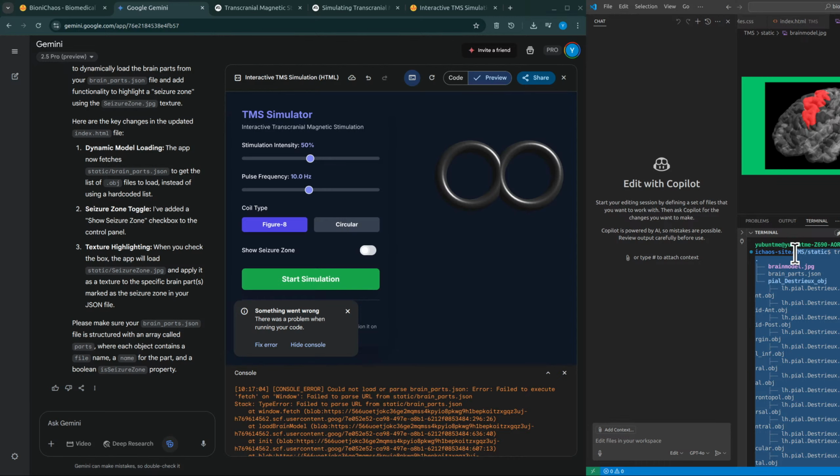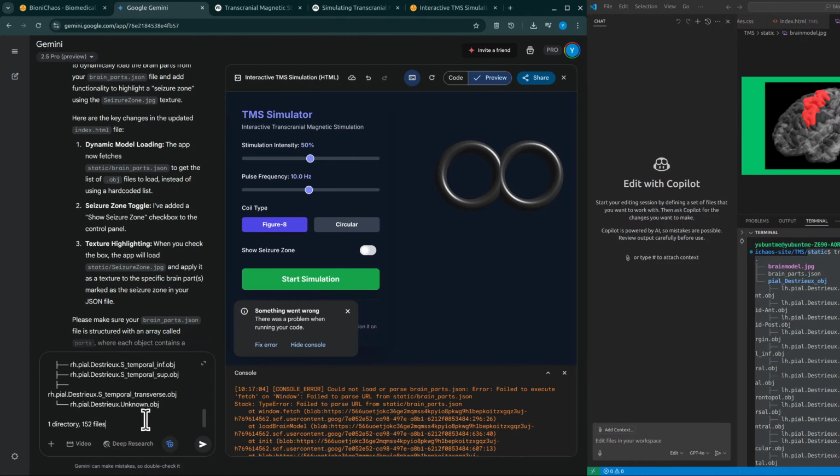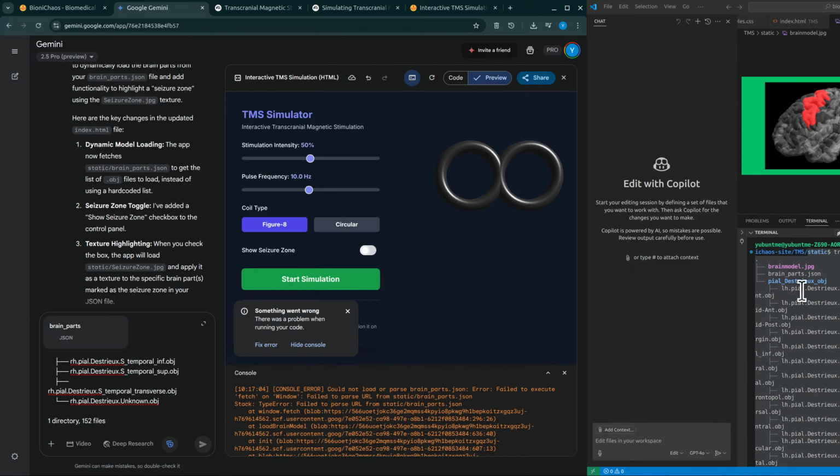So the MRI gives you the picture, like the raw anatomy, but the simulation needs to know what kind of material each bit of that picture is. Right. How do you go from just an image to knowing this is skull, this is brain? That's the next really crucial step: image segmentation. The MRI scans get processed to differentiate between all those various tissue types.